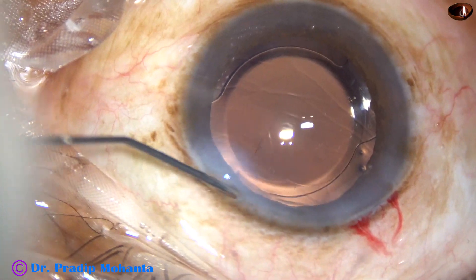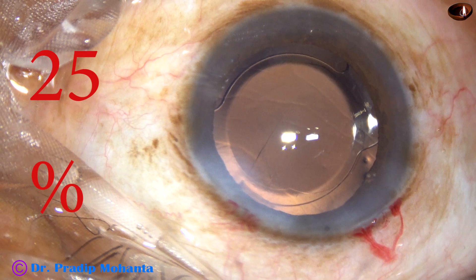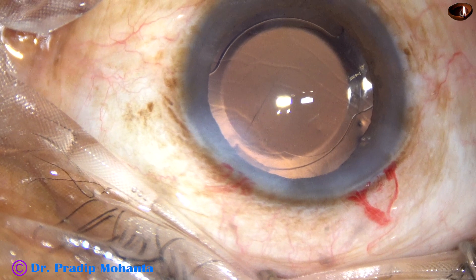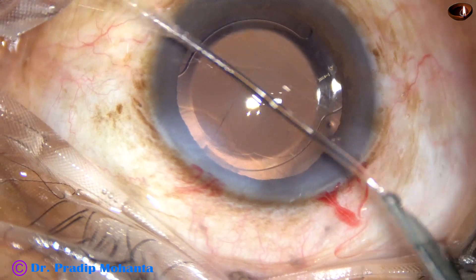This is a bit of moxifloxacin, and now the side port is closed by corneal stromal hydration. I want to show one more thing: at 25% speed, the removal of viscoelastic from the corneal endothelium — this can be done best with a Simcoe cannula.